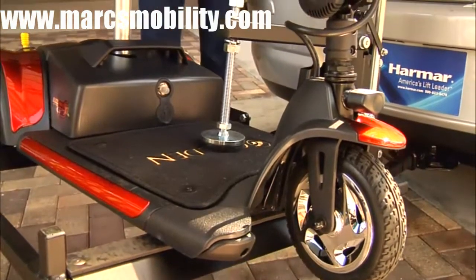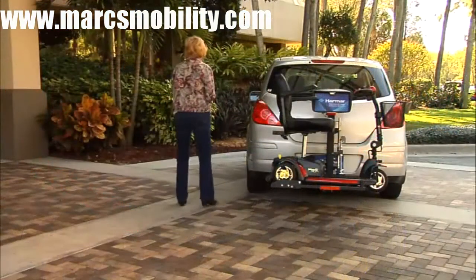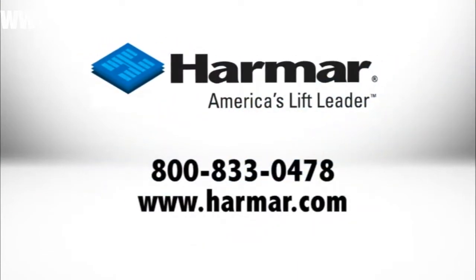The automatic hold-down foot secures your power scooter safely. Stay on the go easily with the lightweight AL-160 Profile Scooter Lift from Harmar, America's lift leader.